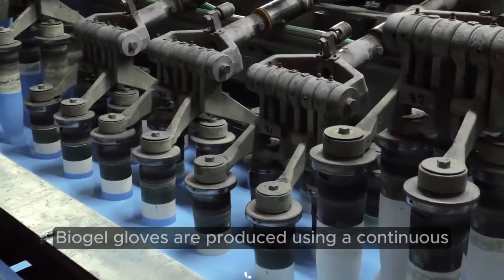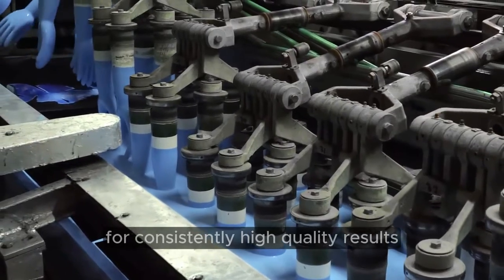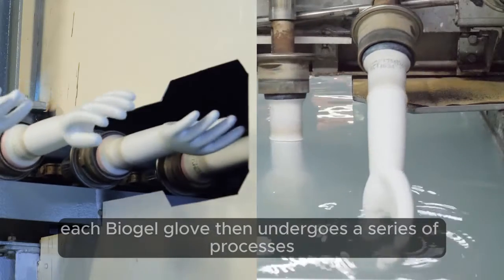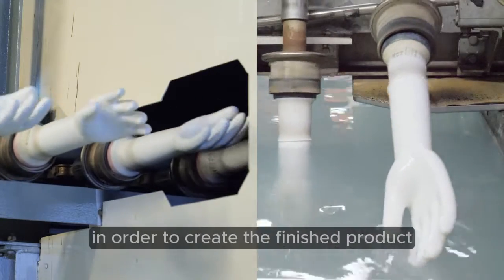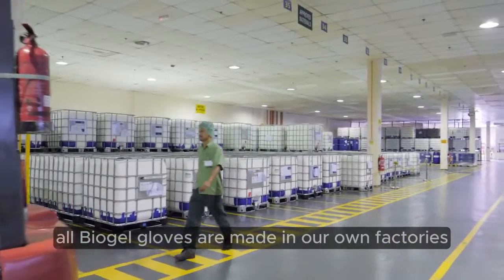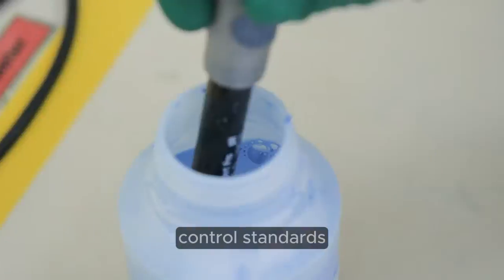Biogel gloves are produced using a continuous automated dipping line for consistently high-quality results. Each Biogel glove then undergoes a series of processes, including curing and leaching, in order to create the finished product. All Biogel gloves are made in our own factories, ensuring that we maintain our high quality control standards.